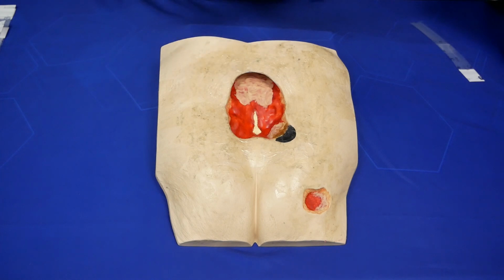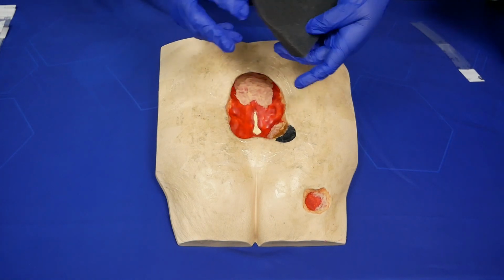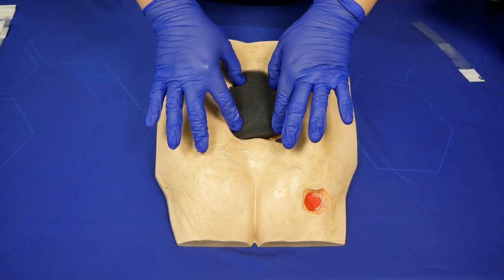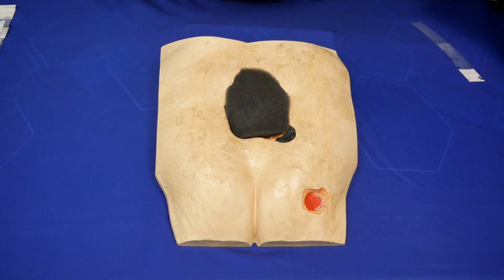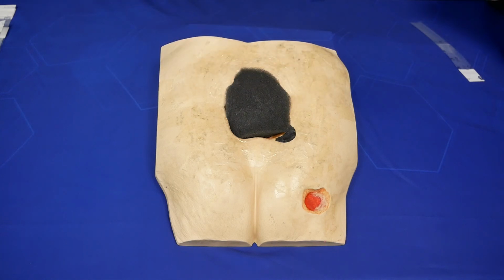And if you have exposed features such as muscle, bone, tendon, or hardware, you should be protecting those features from the black foam. So we would just put this in here. The fit is snug but not tight, because we don't want to overpack the wound. Now that we have our black foam in, we're ready to cover the whole entire dressing with a piece of drape.